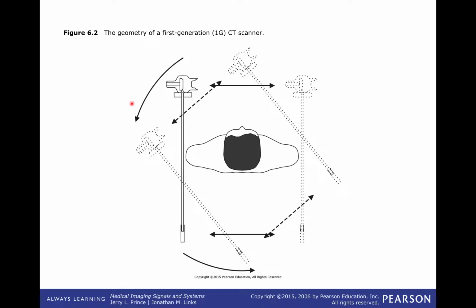Okay, so let's look at how that data is collected, and we're going to go through progressively more complex machinery, basically to collect the same data, just more quickly.